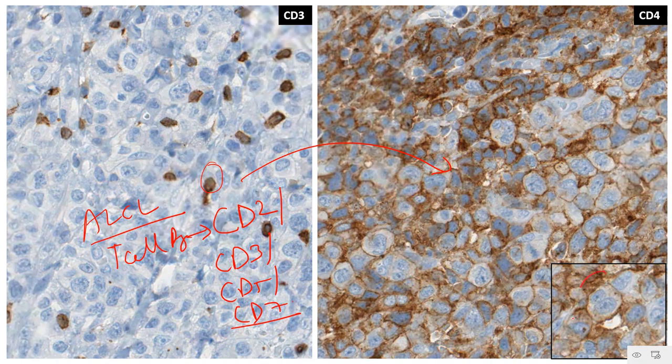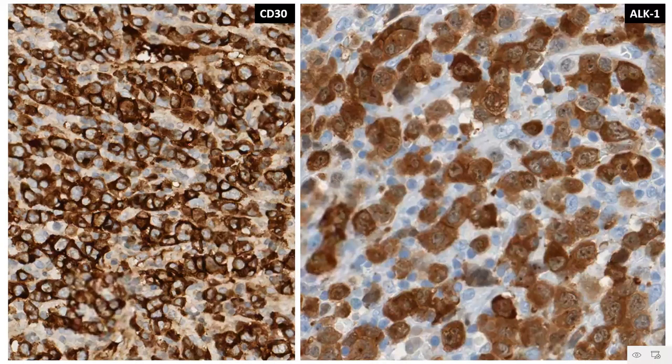Observe the inset. You see that one of these atypical large cells, which has been picked up with CD4, looks a bit like a Hodgkin Reed-Sternberg cell, right? With a binucleolate kind of an appearance. CD30. Like I said, CD30 is a marker which is strongly expressed with membrane as well as Golgi zone positivity in the case of Hodgkin lymphoma, right? But even in this case of anaplastic large cell lymphoma, you have a strong positivity in the same kind of fashion as you see in the case of classic Hodgkin lymphoma.